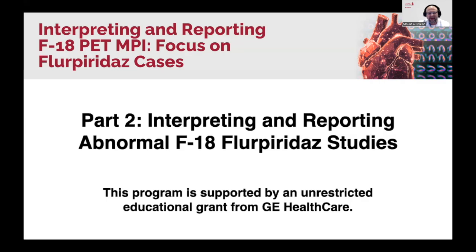This webinar series, funded by an unrestricted education grant from GE Healthcare, is based on two reader training sessions held earlier this year where cases were reviewed from my computer using two different software packages, and we come up to a consensus on how to interpret these studies.